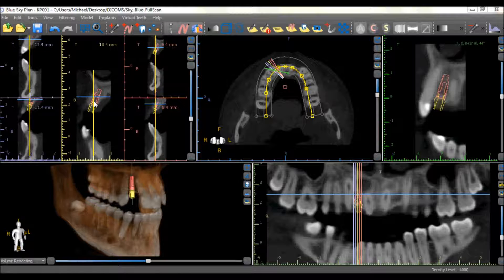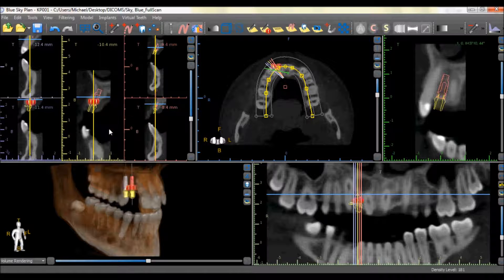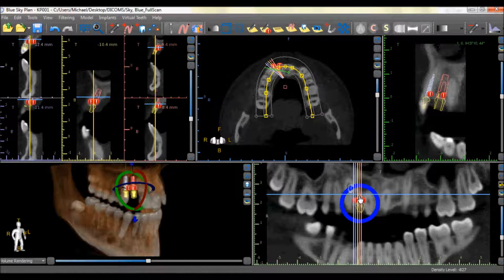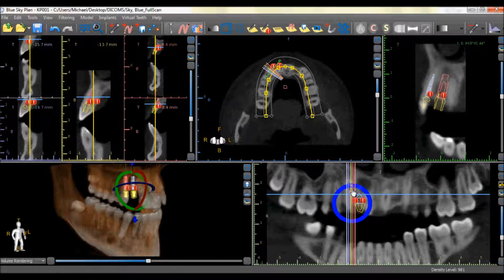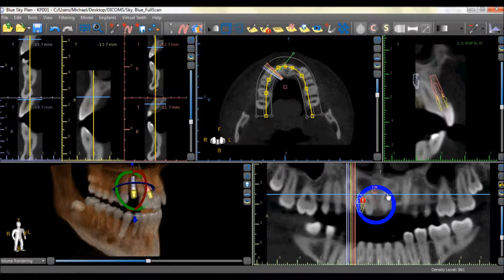Alternatively, the implant can be duplicated by right-clicking on the implant and choosing the Duplicate option. An identical implant in the same angulation appears behind the original implant. The implant can then be dragged to its desired location.